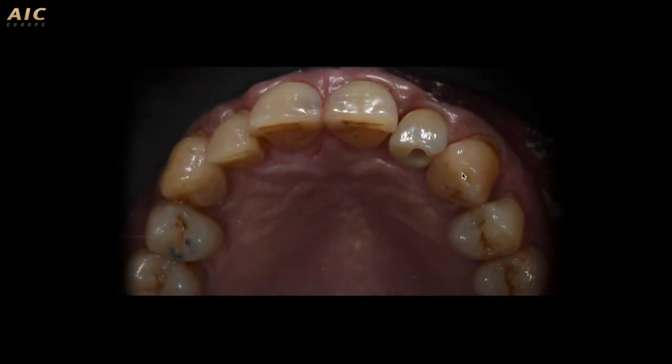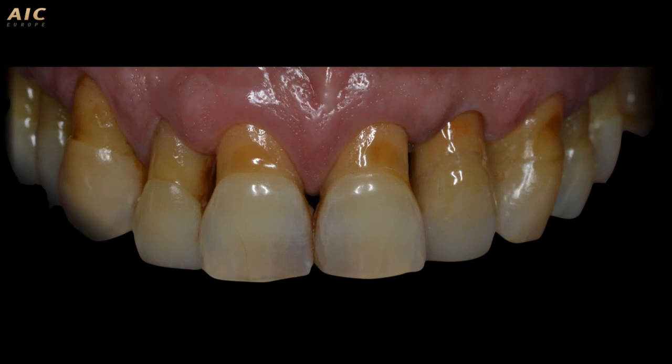This is the occlusal view of this ceramic work, and we can take a look at the screw hole of the angled screwdriver, and this is the final result of a monolithic zirconia without the hole on the vestibular part, because thanks to the angled screwdriver we can turn the hole of the screw to the palatal side.